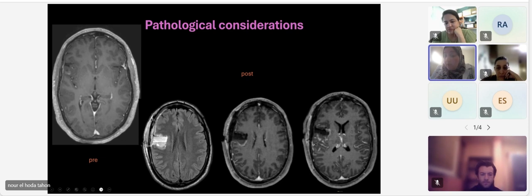It is way more than what we saw before, right? When we say, okay, we can expect some meningeal enhancement, but not like this, right? I don't know, maybe the patient has a recurrence in this area. I can say maybe this is reactive meningeal enhancement as a post-surgical change. And this fluid level should be expected as blood. We can expect some blood in the surgical cavity, and also in FLAIR you can see the blood very well.